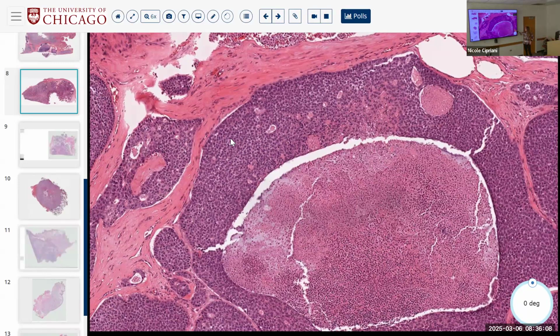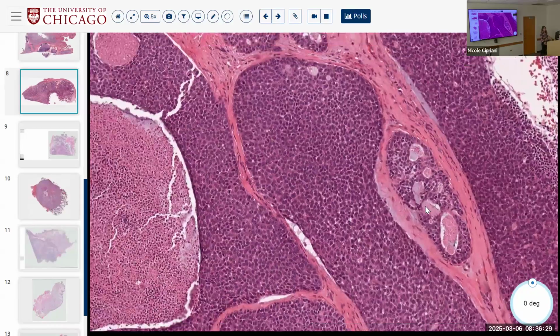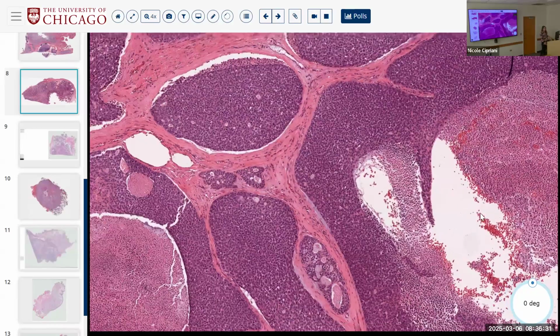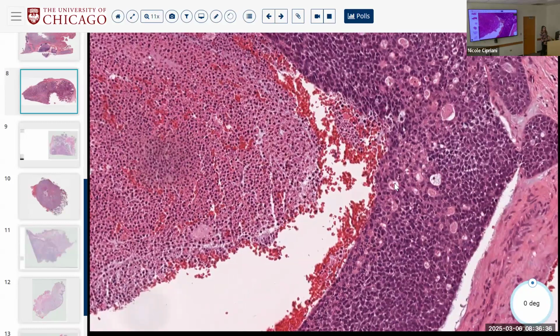This looks very blue and basaloid with not a lot of cytoplasm. Is this compatible with what you normally expect in a salivary duct? Not really. Salivary duct is much more almost apocrine, with lots of voluminous eosinophilic cytoplasm. And you can also say, well, there are these cribriform spaces or Roman bridging spaces that you talked about in salivary duct. Oh, here, so that's present. True. But again, the cytomorphology doesn't really fit.